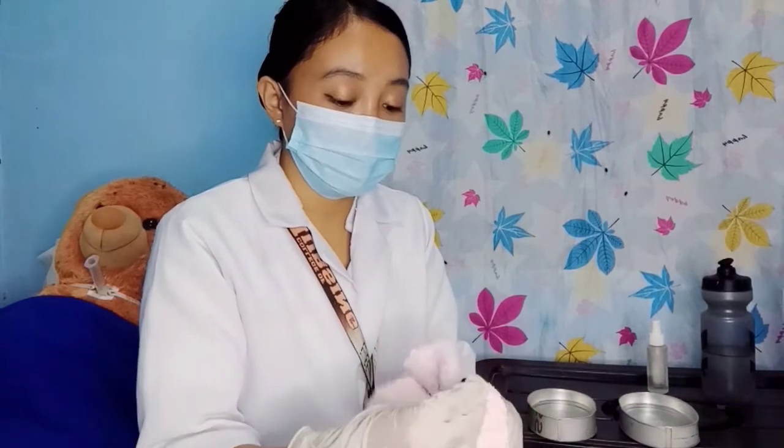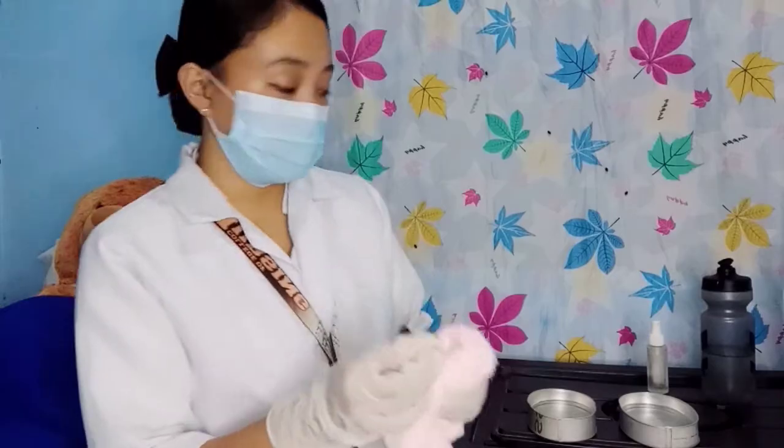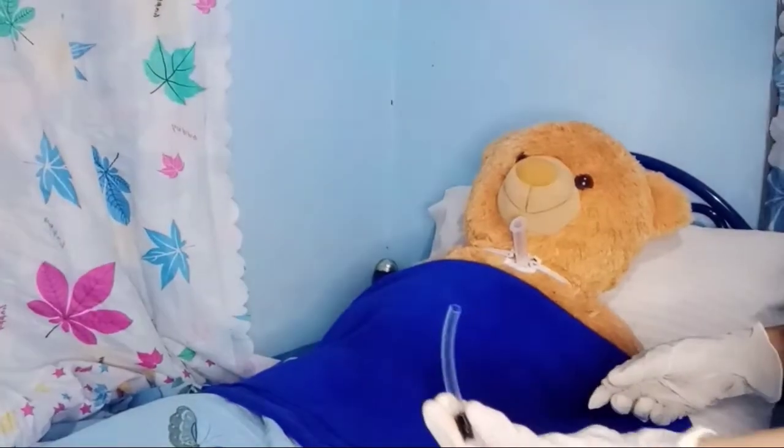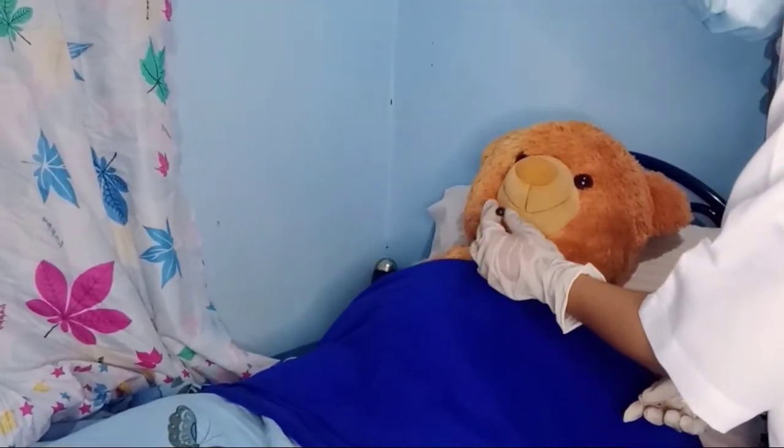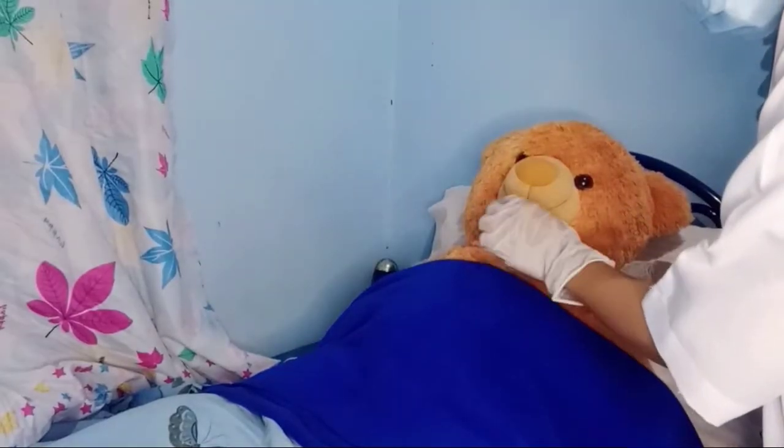Once we have ensured it is dry, the next procedure is to reinsert it back into the tracheostomy tube and make sure it is properly locked. Sir, I am reinserting your inner cannula now. Next, use a cotton tip applicator or gauze sponge and cup or basin with sterile saline to clean the stoma and under the faceplate.